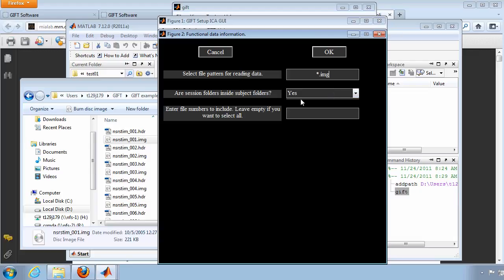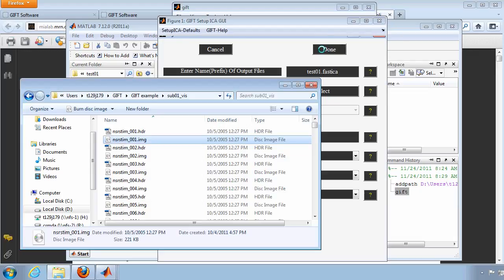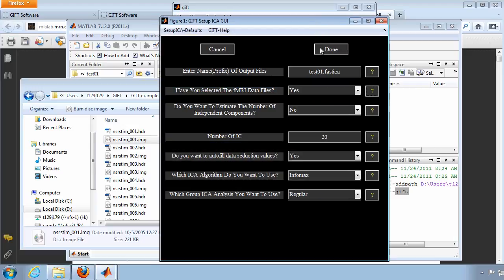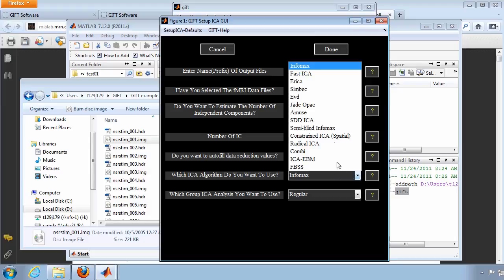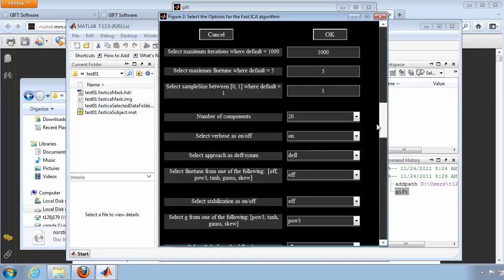This experiment has only one session, so change Yes to No for that option. By default, GIFT will analyze all files unless you specify a certain range only. Click on Infomax and choose the FastICA algorithm instead. Use all other defaults unless you know why to specify something else.